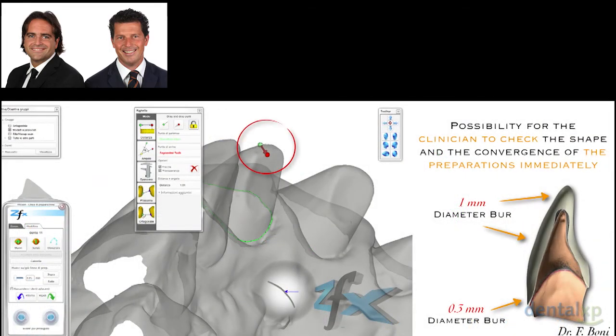Moreover, it's possible to immediately check, for example, the shape and the convergence of the preparation. This is crucial for milling strategy purposes and to avoid internal voids once the final restoration is cemented.